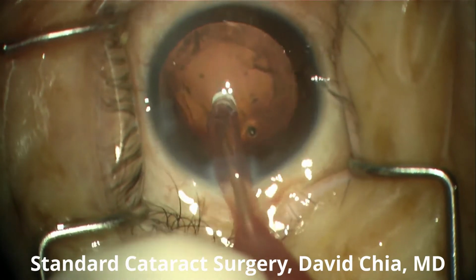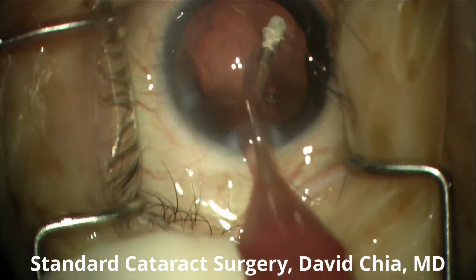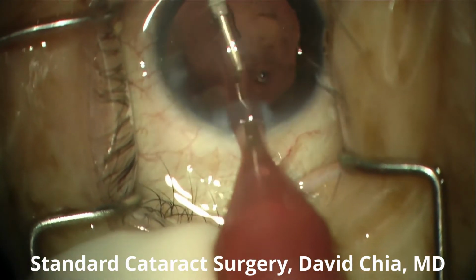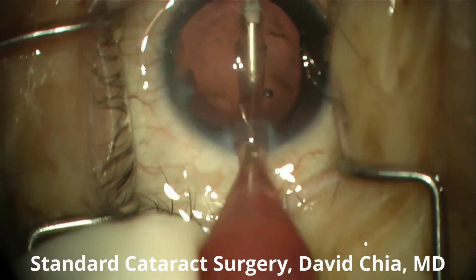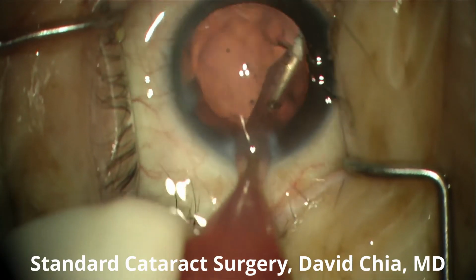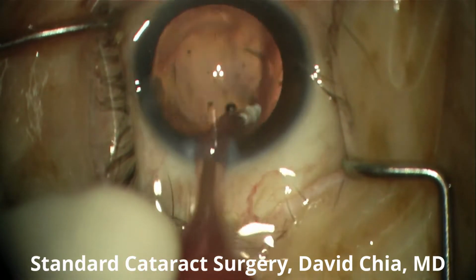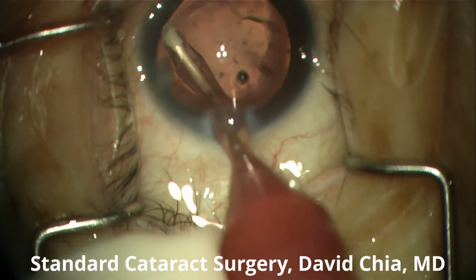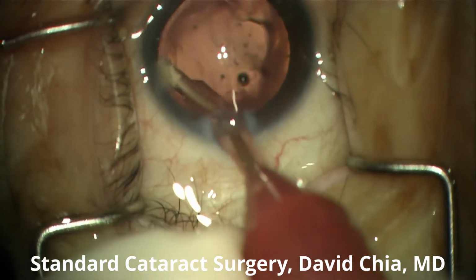And we can use this to try to remove some of the lens epithelial cells, and this will help to prevent capsular contraction and phimosis. In other words, we want some scarring to retain the lens, but not an excessive amount of scar tissue that might cause problems later. So here we're polishing both the posterior as well as the anterior capsules.